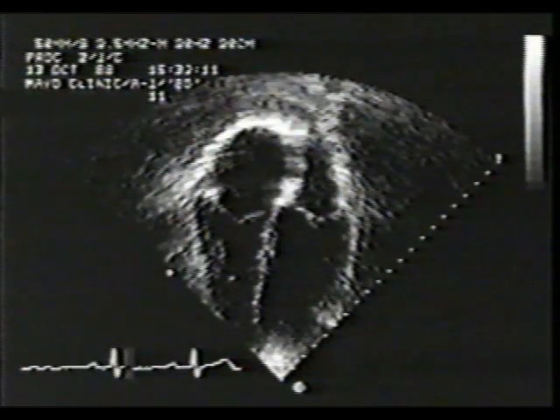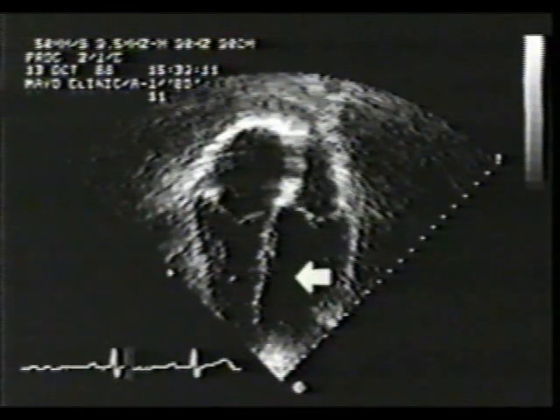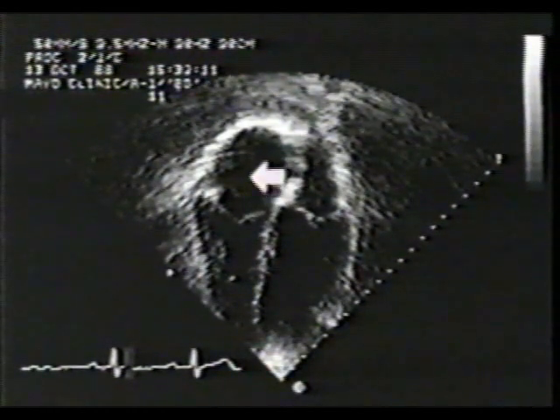This is the apical fourth-chamber view of another patient with severe pulmonary stenosis. This patient is 72 years old. We are demonstrating the apex down orientation with left atrium and left ventricle in this position, right ventricle and right atrium here. Note that the right atrium is moderately enlarged.